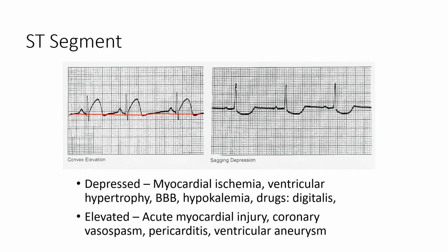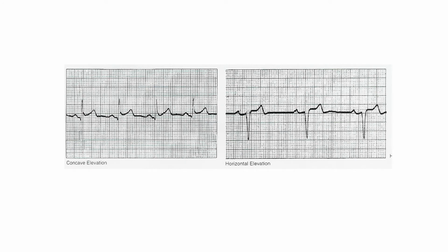But if you see ST elevation, that's significant. That means that the patient's having a STEMI and they need to have a 12-lead EKG done as soon as possible, within 10 minutes, and notify the provider. Here are some other examples of ST elevations. Again, if you're drawing your isoelectric line, they're above it. And again, 12-lead EKG: if you are a monitor tech, you would be notifying the nurse. If you're the nurse, you would get a 12-lead EKG and notify the provider, potentially even calling a rapid response.